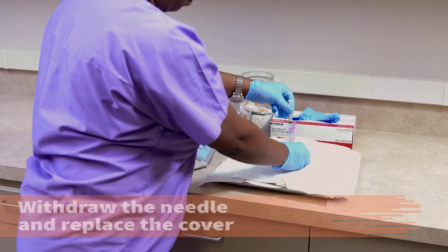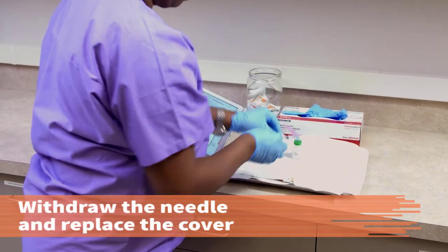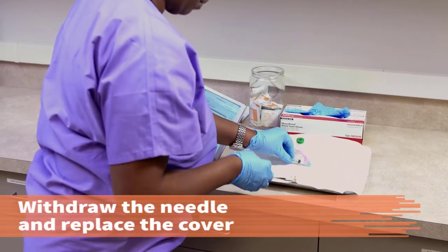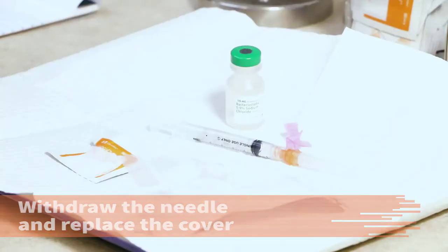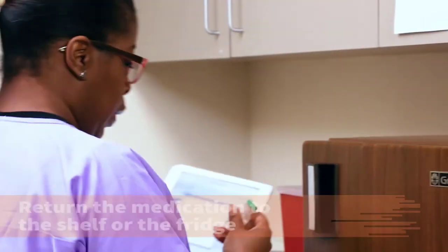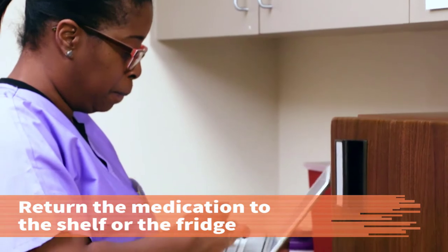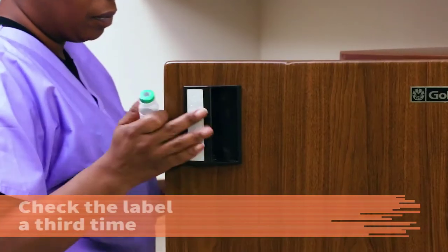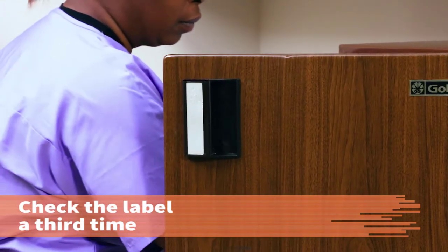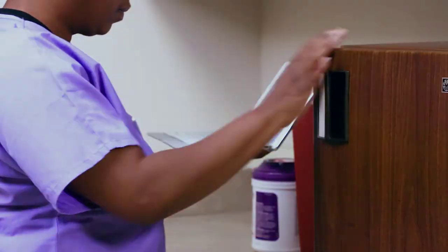Withdraw the needle from the vial and carefully replace the needle cover without letting the needle touch the outside of the cover. Return the medication to the shelf or the refrigerator. Check the order against the label one more time to complete all three label checks.